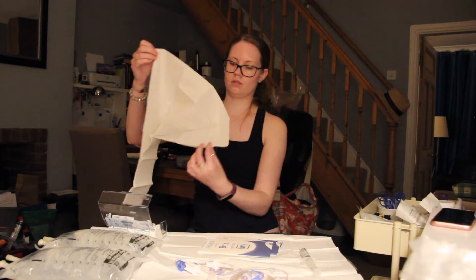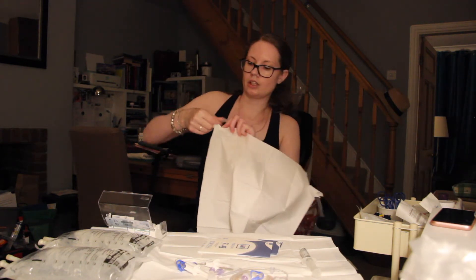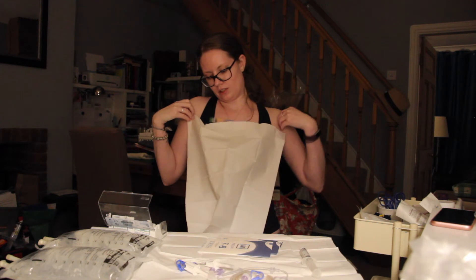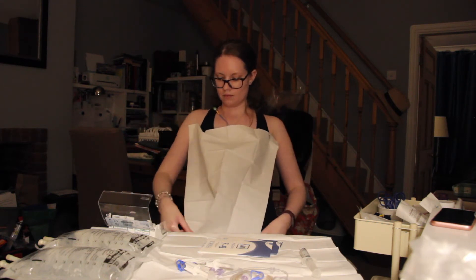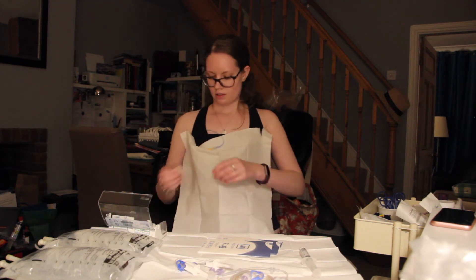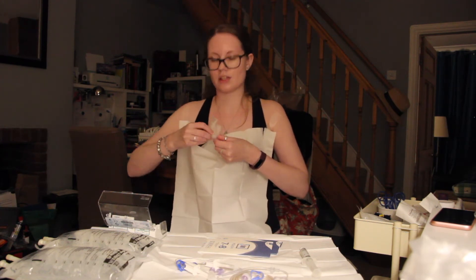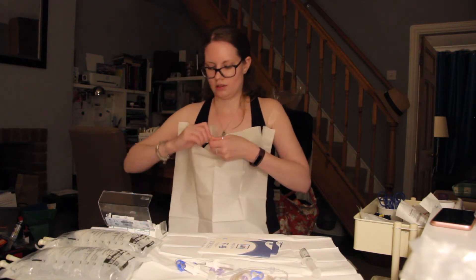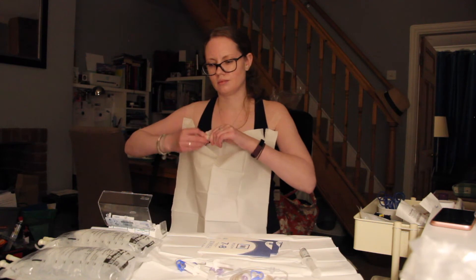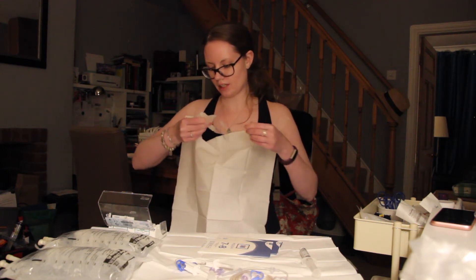So I'm going to open it up, stick the tape on each corner, and then put my line up into my neckline and stick the sterile field to me. And then take my third — fourth sanicloth and clean the line for 15 seconds once I've taken the little green cap off. Okay, so that's 15 seconds. So then I'm just going to clean anywhere on the line I might touch — just the end of it — and drop it on the sterile field.